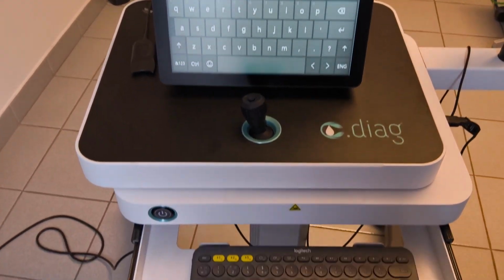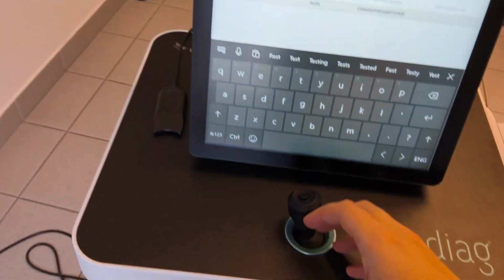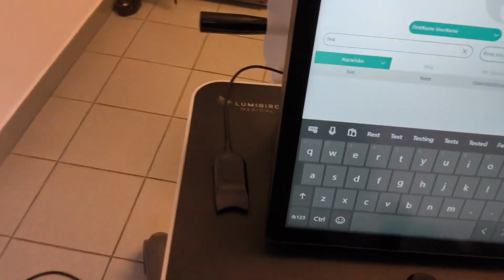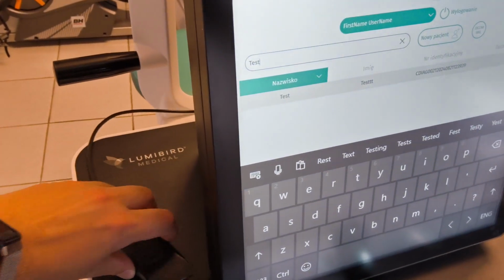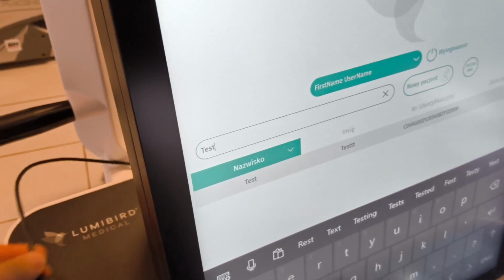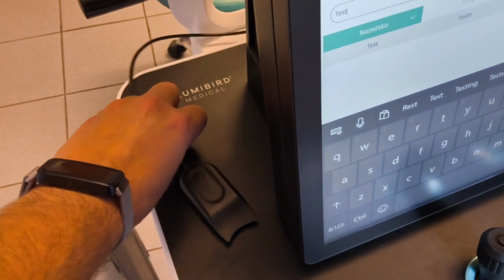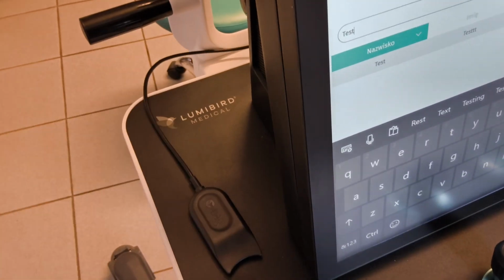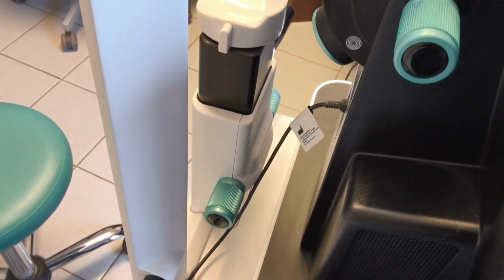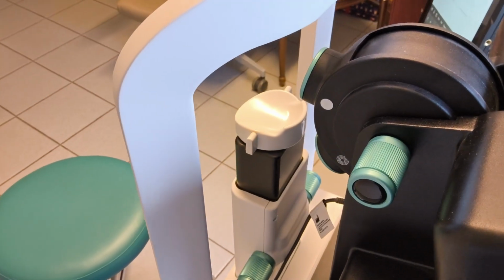You move the machine using a joystick, up and down, right to left. And then if you wonder what is this on the left side, this device, this is more or less a magnetic lid everter, and it's on magnet, so you don't lose it. If you fall, then it clips. So it's a very useful feature. It's connected also, so somebody won't steal it from you. I'm going to show you how it works.